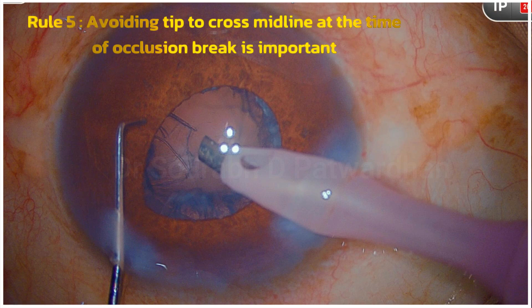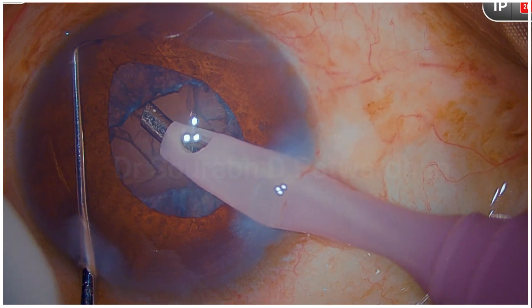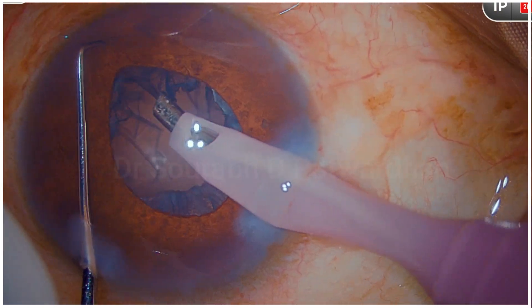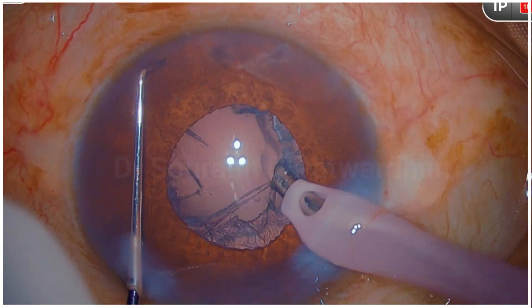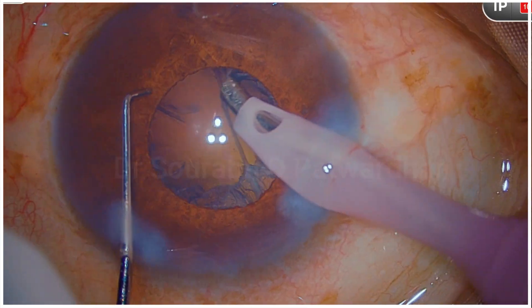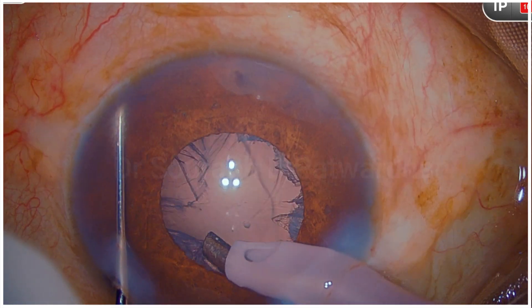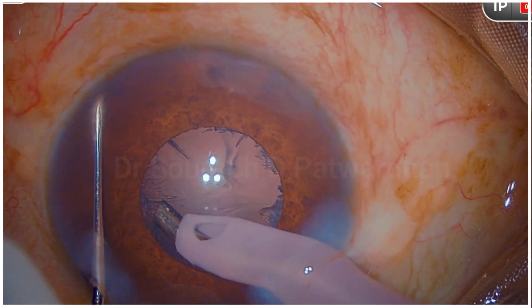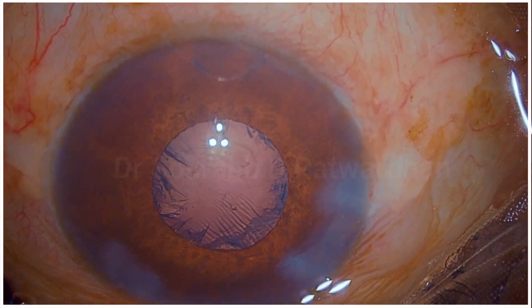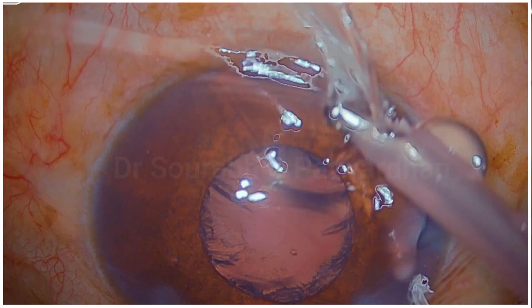Avoid trying to take out even small amounts of epinucleus or cortex in such cases — I am demonstrating here to show that you will not damage the iris if your rotation and tip position are correct and you are retracting the iris away. This is just to demonstrate the principle.